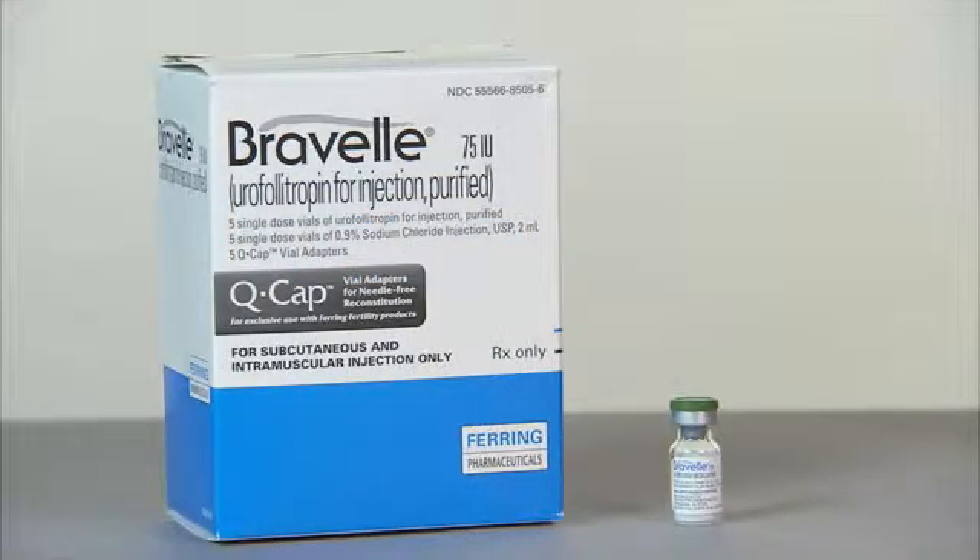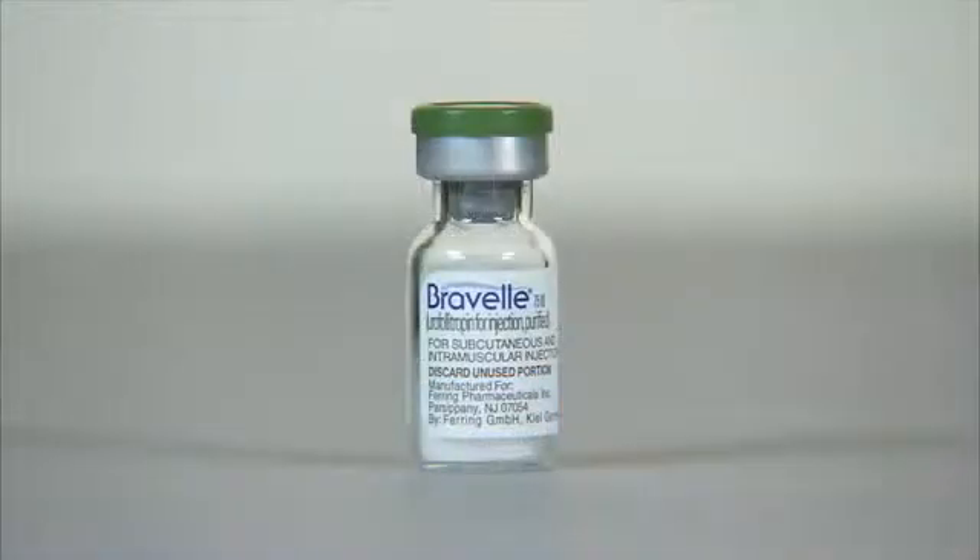You've been prescribed Bravelle as part of your treatment. It's important to take this drug exactly as directed. This video will help you to both prepare your medication and give yourself injections.